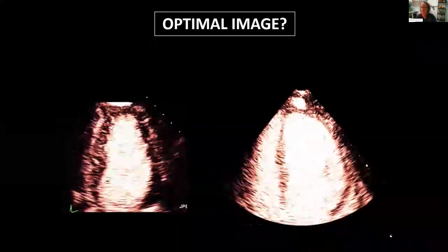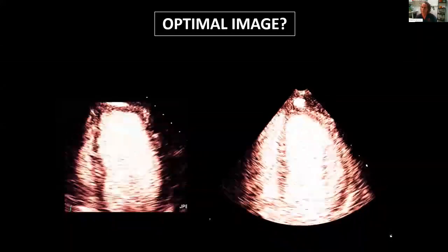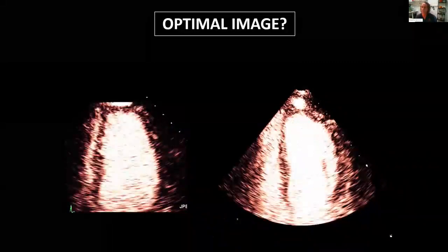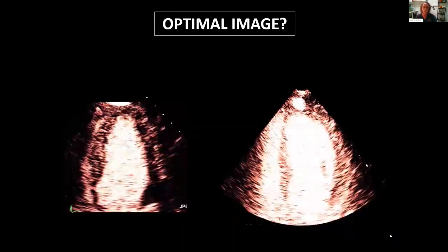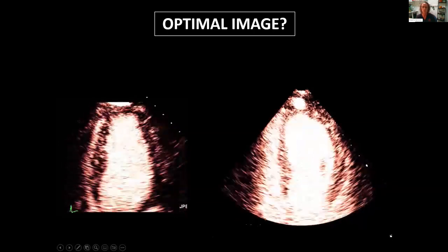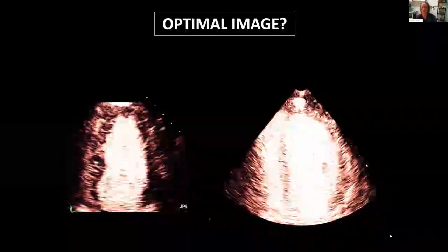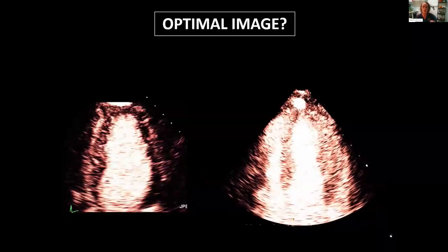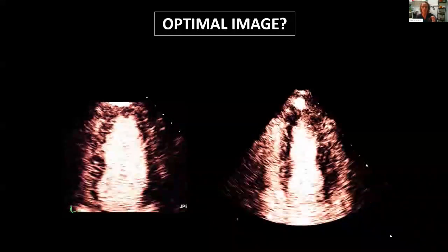Now, here's another question. Are these optimal images? The image on the left might be if we're making a volume or LVEF measurement, but it is not if we're looking for perfusion in the myocardium. On the left, beautiful endocardial borders, epicardial borders, we can appreciate the thickening of the myocardium, but the image on the right allows for the imaging of the microbubbles within the myocardium.